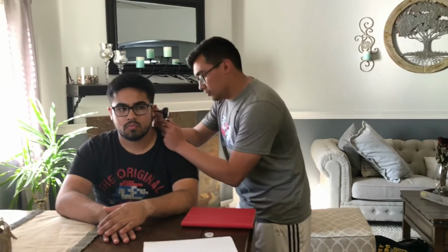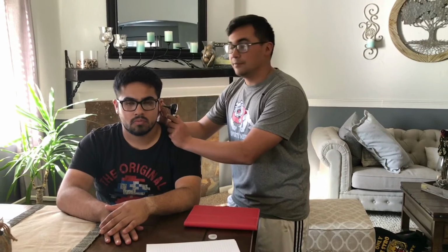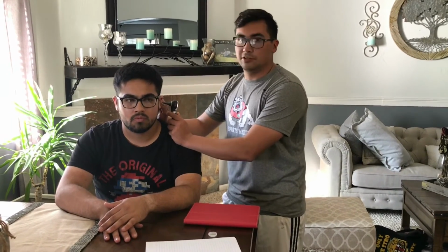I'm going to be looking for three things actually. I'm going to be looking for any white spots on the tympanic membrane, which could indicate tympanic sclerosis. I'll be looking for any holes in the tympanic membrane, and I'll be looking for any excessive earwax that could indicate to patients hearing loss or decreased hearing.